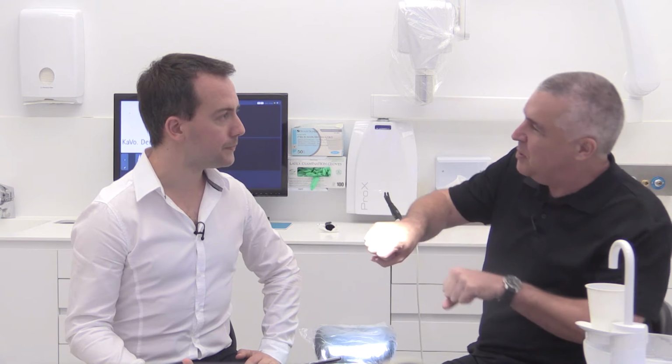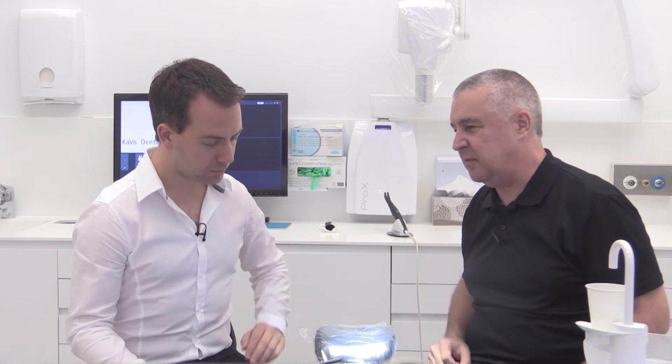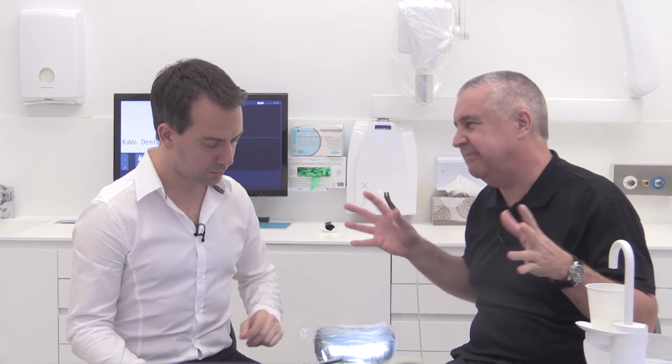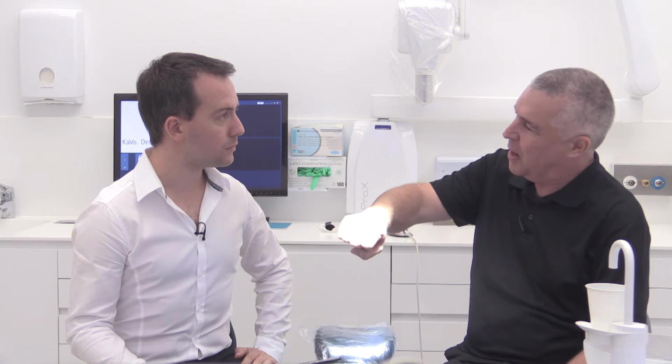It's just a question of moving the angle around to get exactly the view that you want. Because of the way that arches curve, even when we line up a patient for an ideal bitewing view, we often see a few areas of overlap, and we say, okay, that's just the way it is. Whereas with this, we can spend a few moments getting exactly the right position of the tip to make sure that we don't get anything other than exactly the view that we're looking for. So I haven't found that a challenge.